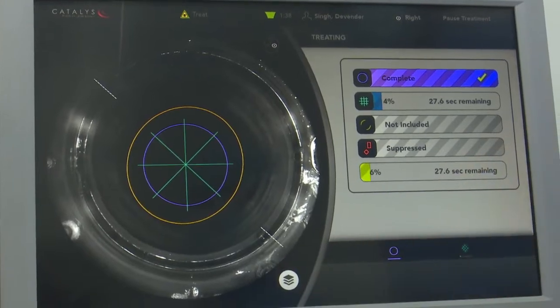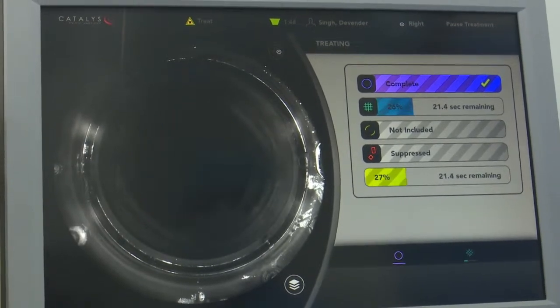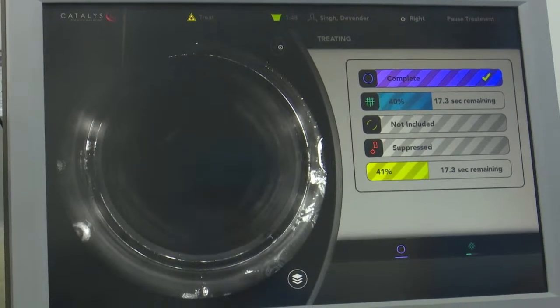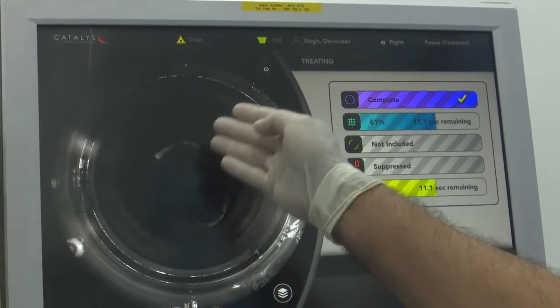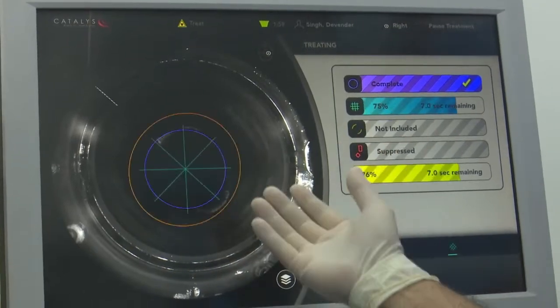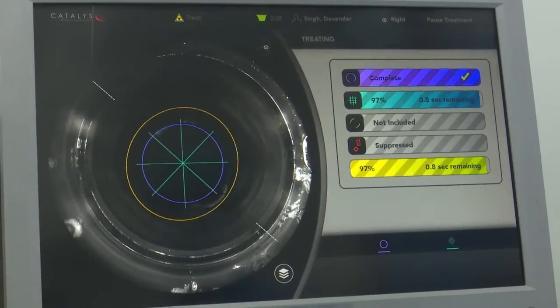Right. So the capsulotomy is complete, and we're going on with the fragmentation. I'm making the octants as I did feed it into the machine, and that takes about 28 seconds. So we've got another 17 seconds to go. The patient is comfortable. There is no problem. I can see the fragmentation happening in front of me, and I can actually see the capsulotomy with the pneumobubbles which are coming up. I can actually see the capsulotomy, which is a free-floating capsulotomy now.